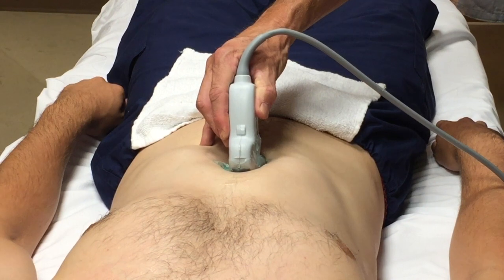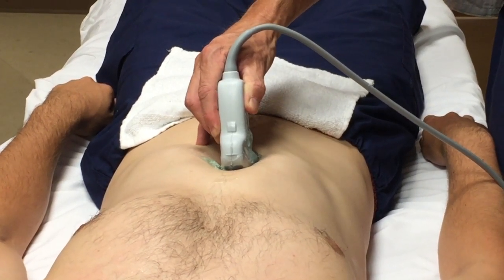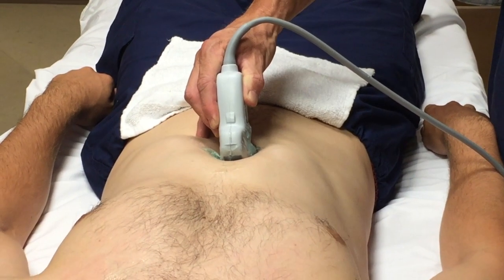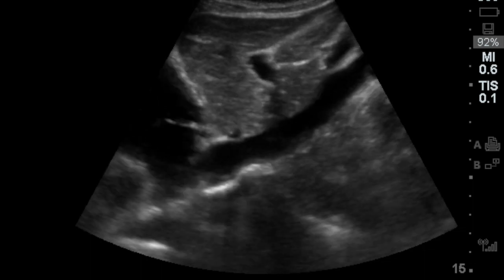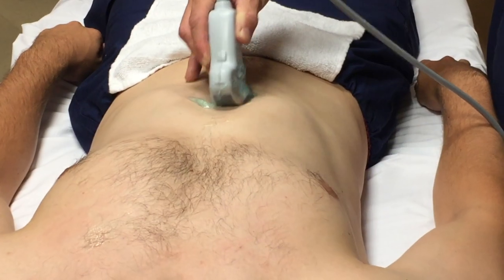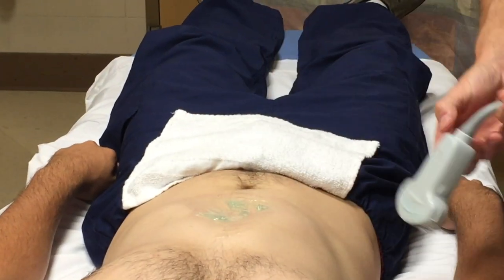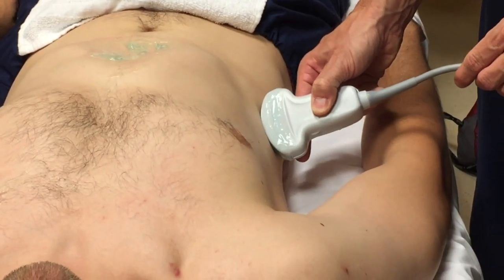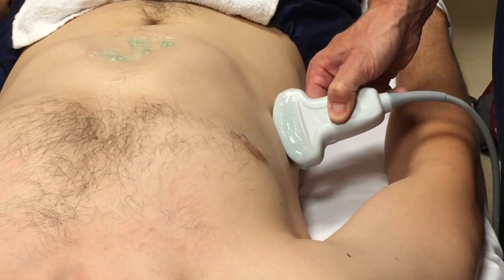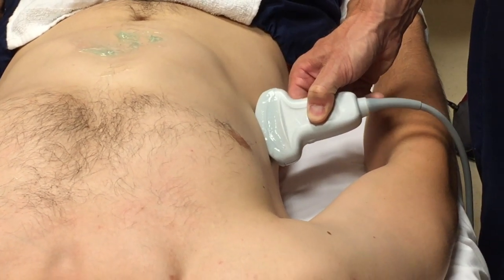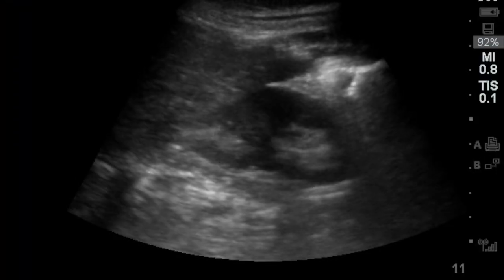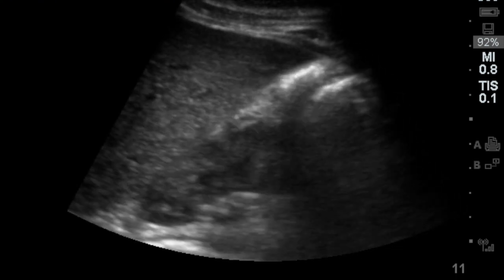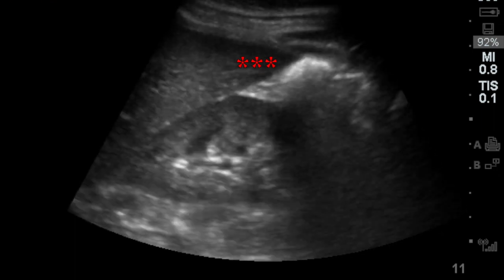For the IVC, I have my probe marker pointed up, just a little bit right of midline, angled up towards the patient's heart. That gives me a good view of the IVC heading into the right atrium. I'm mostly looking — is it dilated, is it flat, or somewhere in between? For Morrison's, I take a look over the right upper quadrant. I like to have the probe a little oblique to sneak in between the ribs, and I'll fan through Morrison's, paying close attention to the tip of the liver looking for a black stripe or any signs of free fluid.